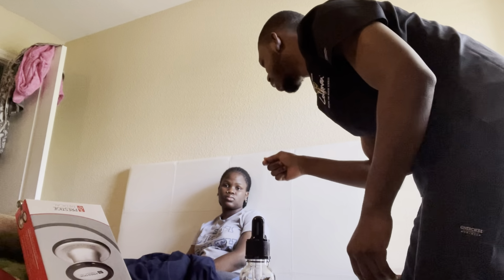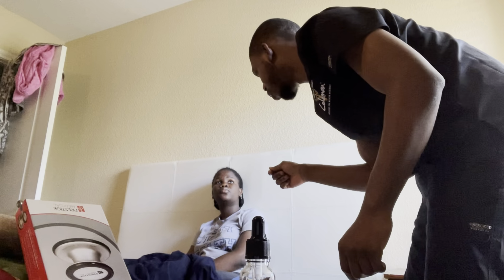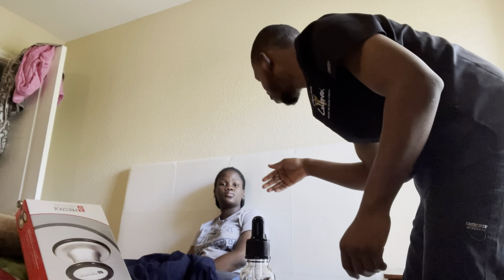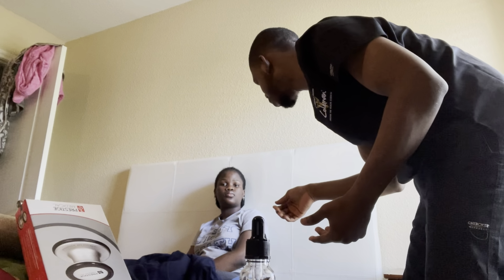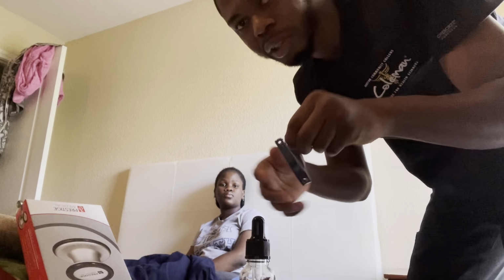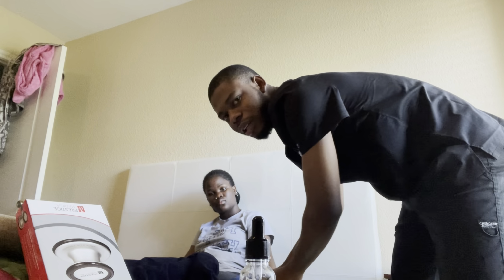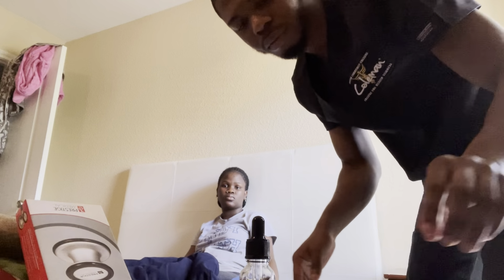Today, I will be suctioning your nose so that I can clear the secretions in your nose to your lungs in order for you to be able to breathe well. Are you okay with this procedure? Yeah. Thank you. Now that she's okay with the procedure, I will take my pulse oximeter and apply it on the patient in order to monitor the patient's oxygen saturation level.